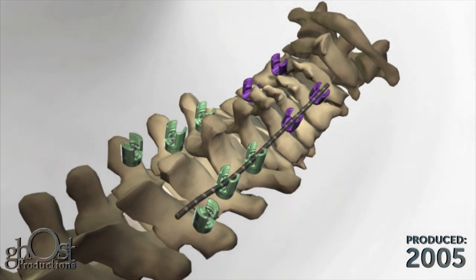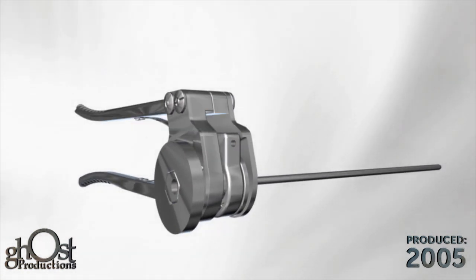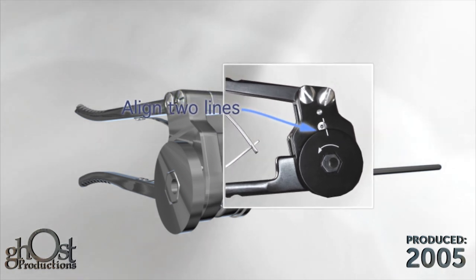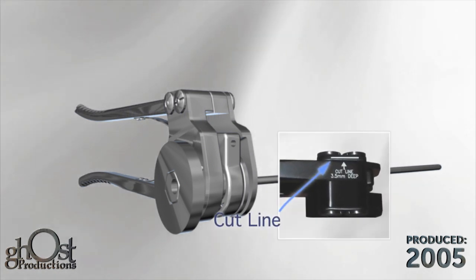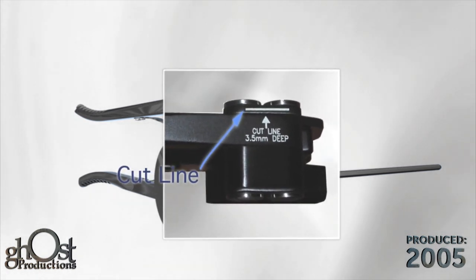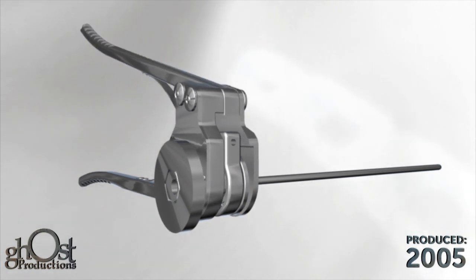The rod template may be used to determine the appropriate curvature and length of rod. Use the ratcheting rod cutter to cut the 3.5 millimeter rod to the appropriate length. Prior to inserting the rod, align the two lines on the rod cutter by rotating the cutting wheel counterclockwise. Place the rod through the left side of the rod cutter with the desired rod length exposed on the left side. Squeeze and release the rod cutter handles, repeating until the rod shears off smoothly.